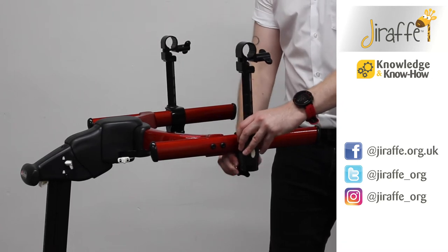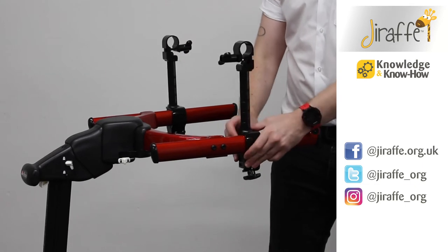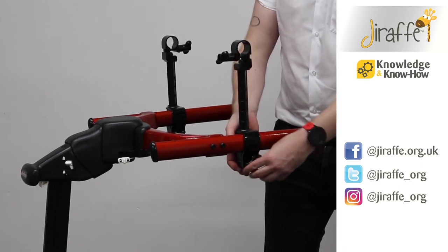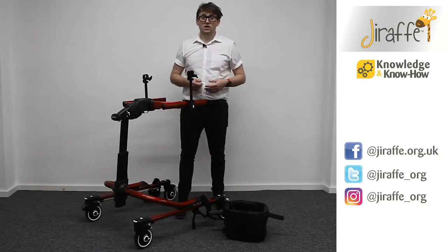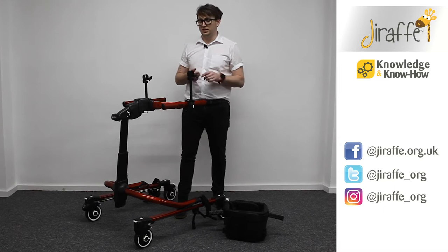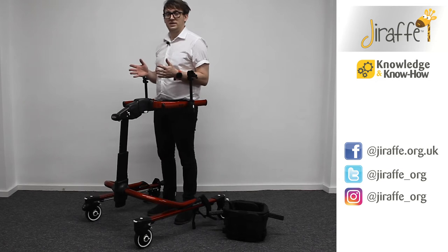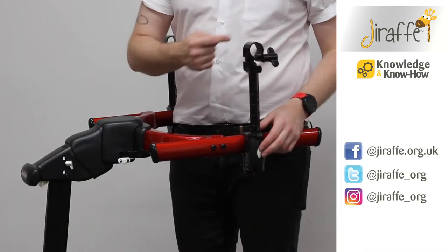Alternatively, you're also able to use the clamps in an inward facing way so that the chest prompt becomes closer together. Before fitting the chest prompt, ensure that the wing knobs are behind the client. If you're using the frame in an anterior position, the wing knob should be facing the rear of the frame.